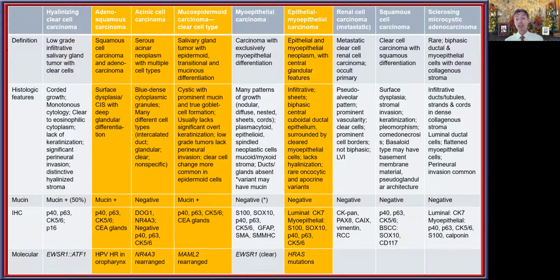So let's look at an example of mucin. Here, first of all, you'll see that it is luminal mucin, which really does not count. But over here, you can see that it is intracytoplasmic mucin, as you can see in this example here and here. And therefore, there is genuine mucin production, although isolated in many of these tumors. Very strong and prominent single cell population with P63, obviously the same with P40, because these are equivalent in this particular setting, although I think the P40 is much more sensitive as a marker in this tumor.